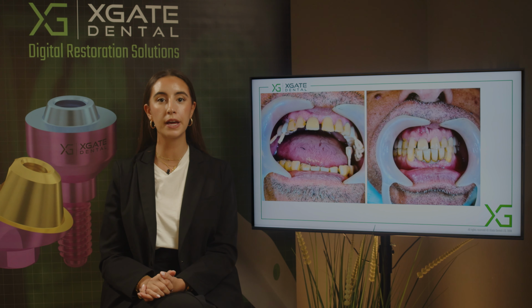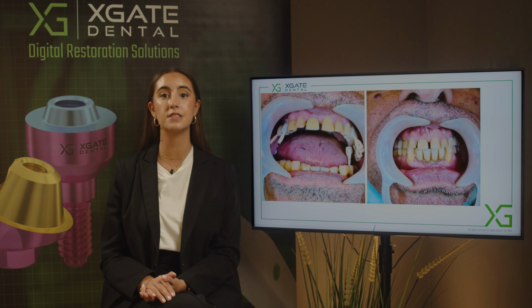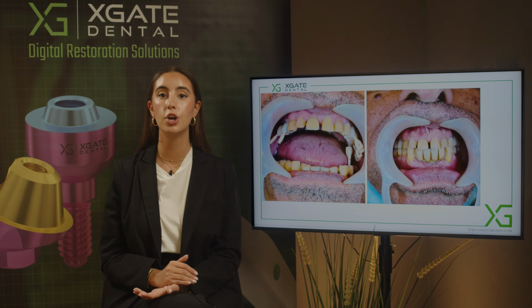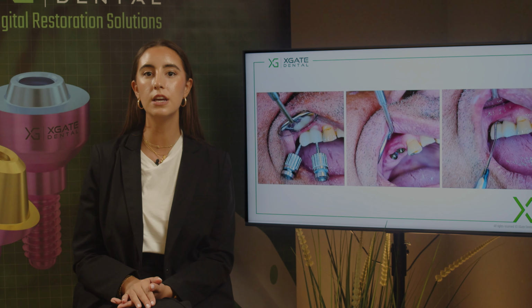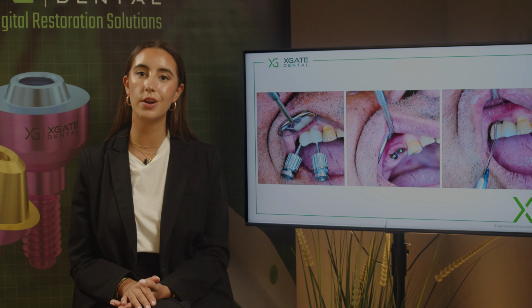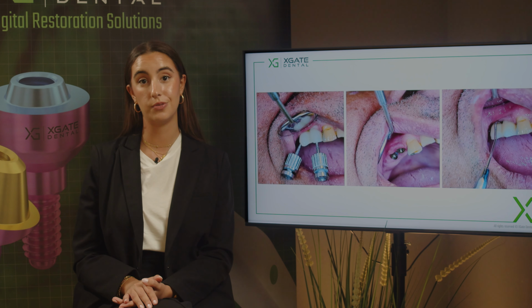Even with the high angulation between the implants and the buccal inclined screw channel, we still can avoid using the angulated multi-units because, due to the small diameter of the screw channel, you can close it quite well and you won't see the aesthetic issue. If you have a big screw channel, it will be a bit of a problem. So we left it the way that it was. If we wanted to use an angulated multi-unit, we would have a problem because you don't have enough gingival height in here, so you will see the metal of the multi-unit.